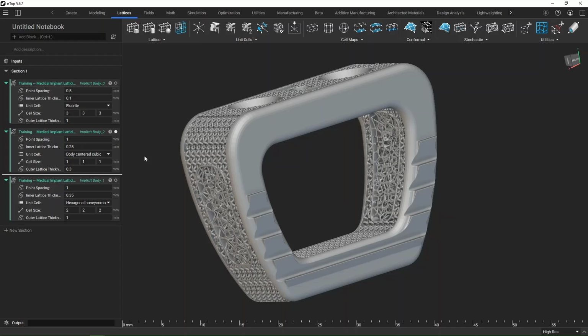From there, we can really start to iterate. Maybe we can start to get into list processing. There's plenty of information on the Learning Center to understand that a bit more, but this is going to help automate that workflow so we can really find that ideal implant, whether it's looking further into that Voronoi for osseointegration or kind of figuring out that right ratio of that periodic lattice for lightweighting as well, but wanting to maintain that structure too.